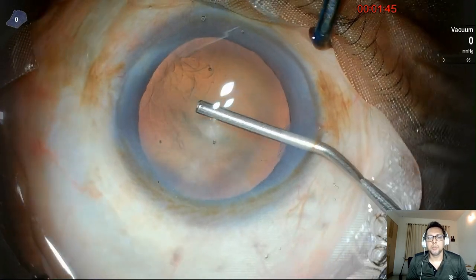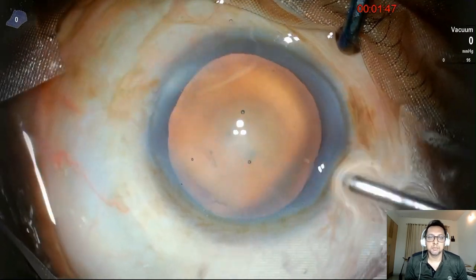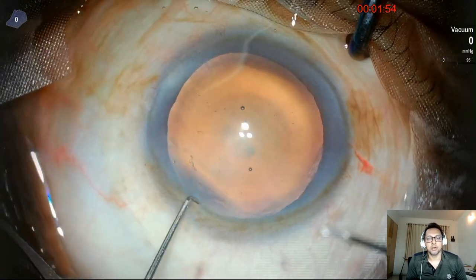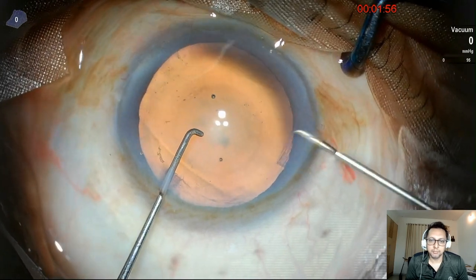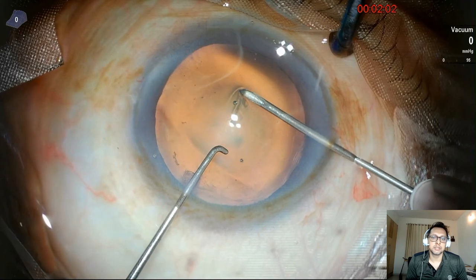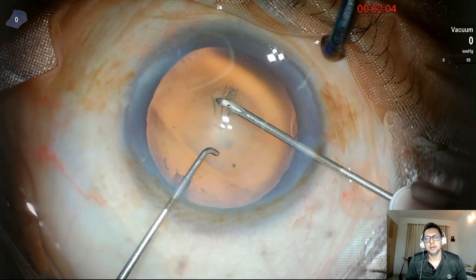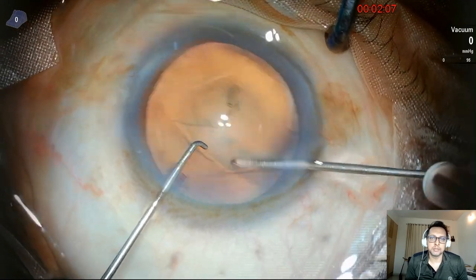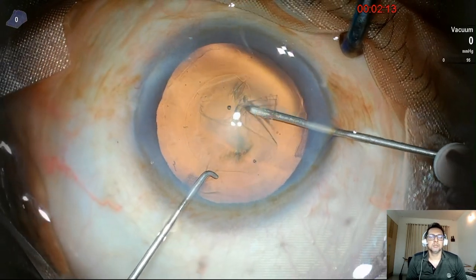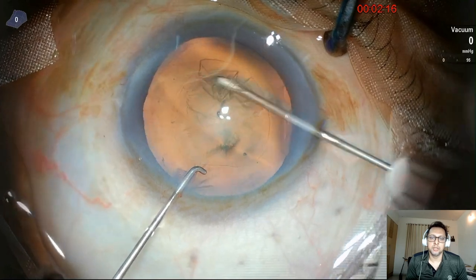I'm going to use 2% HPMC. This is a dispersive agent, and it's always good to use a dispersive agent for coating the endothelium. A few colleagues use only cohesive viscoelastic like 1 or 1.4% hyaluronate, but it's not going to protect the endothelium. So always use dispersive viscoelastic to coat the endothelium.